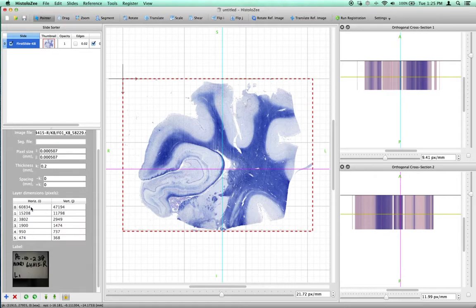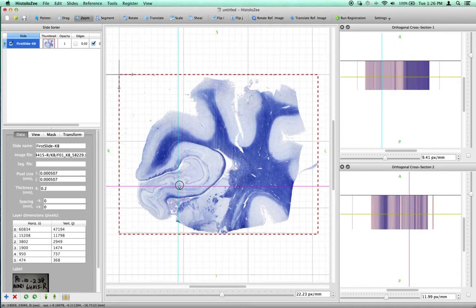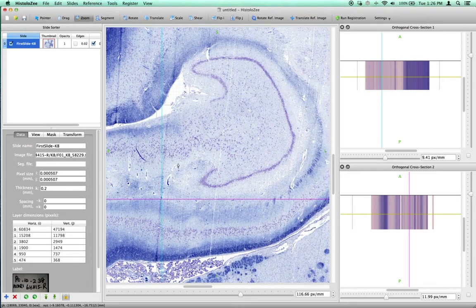The slide actually contains on disk 3 layers, but as we load the slide into our view, we generate 3 more downsample layers until we are below the 512 by 512 threshold. The reason for having multiple layers is to facilitate loading of such large images. We don't actually load the full resolution image all at once, rather we load the image in smaller low resolution chunks. And then as we zoom in, we load tiles of the high resolution images.